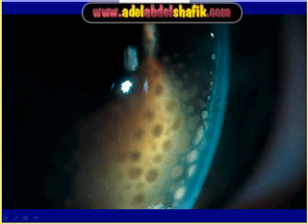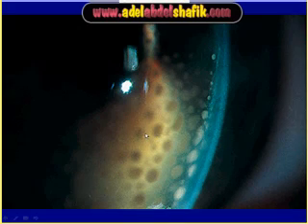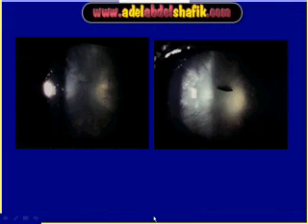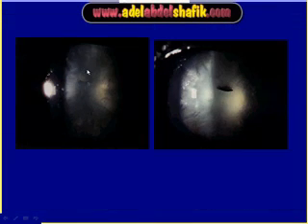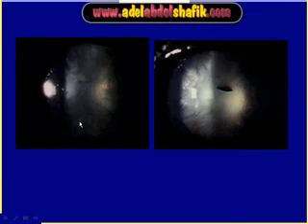Again, you can see some dots here and in the section you can tell they are on the back surface of the cornea — these are large-sized keratic precipitates. You can see them in section, against the illumination of the iris, and against the dark pupillary area. The lens in this case is cataractous.